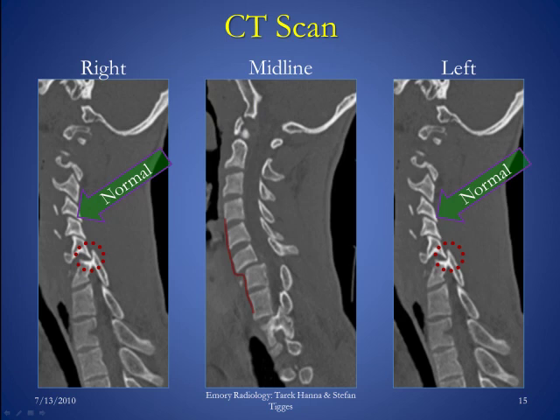Here we have a CT scan from a much younger patient with a similar injury. On the midline sagittal CT image, there is marked anterior displacement of C6 with respect to C7 at both the anterior and posterior cortex, suggesting disruption of both the anterior and posterior longitudinal ligaments. Posteriorly, there is distraction of the posterior elements at this level. On left and right parasagittal images, normal facet joints line up like shingles on a roof, while at the C6-C7 level, facet dislocations are present on both sides, indicated by the red dots.